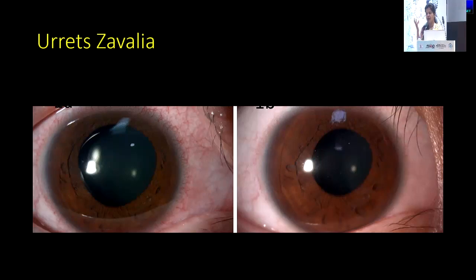And on looking, you can see that the IOP is raised, the cornea is hazy, and the pupil is atonic and looking like that. Now this I thought was a routine post-operative elevation of IOP, which is very, very rare, but I thought some visco might have got trapped somewhere. But even after the intraocular pressure was relieved, it took a very, very long time for the pupil to come back to normal. Even at 2 months, this is how his eye looked.